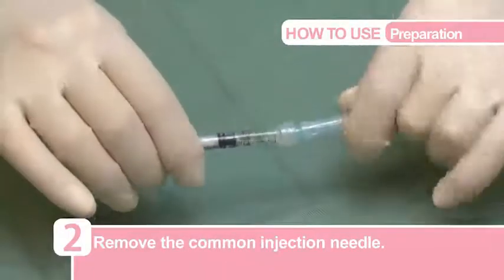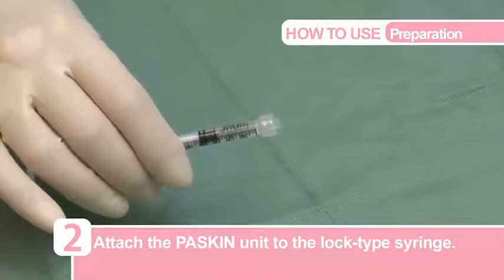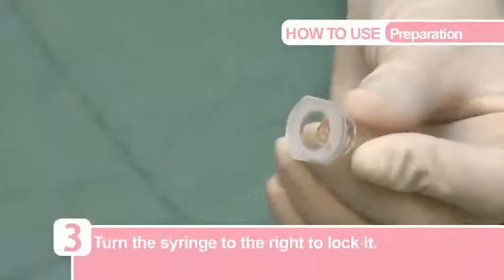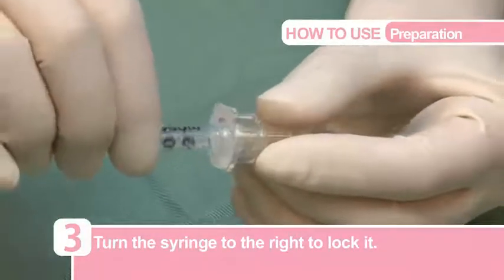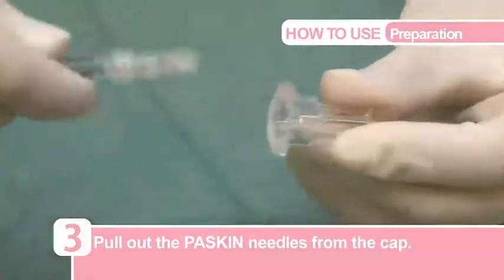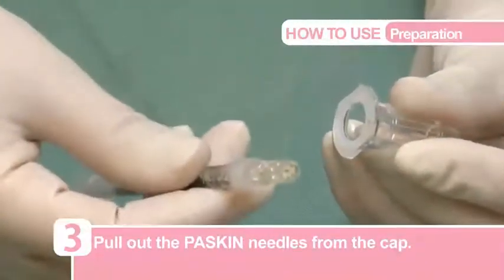Next, remove the common injection needle and attach the Paskin unit to the lock-type syringe. Lastly, turn the lock-type syringe to the right to lock it and pull out from the cap. The syringe is now ready for injection.